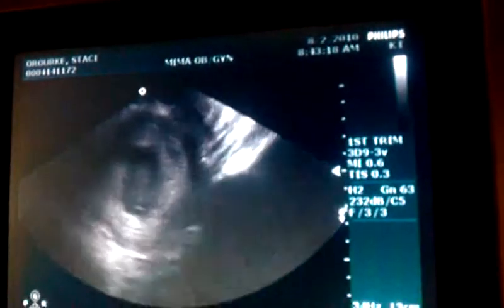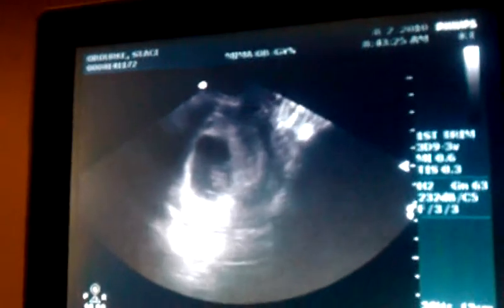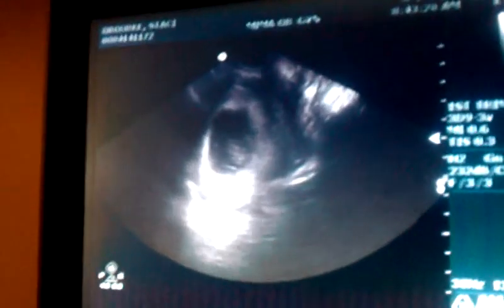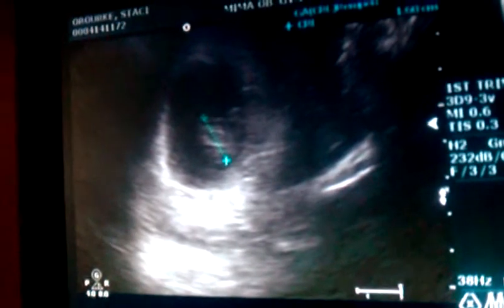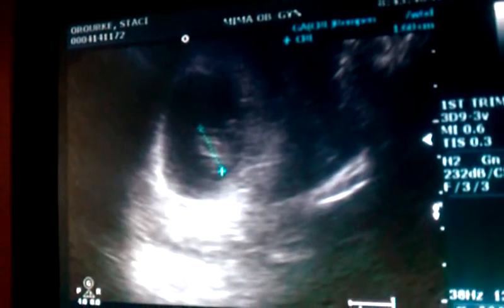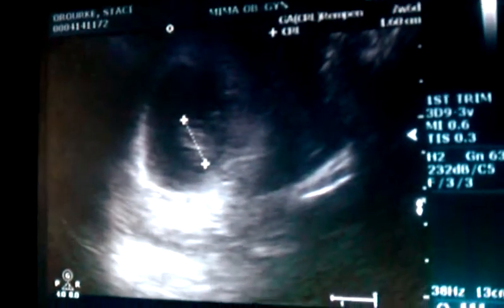Let's go back here and get our best view. I think that's about seven weeks three days — I'm calling it seven weeks six days. We're not going to argue over a few days. This is still way more accurate than anything we had before.